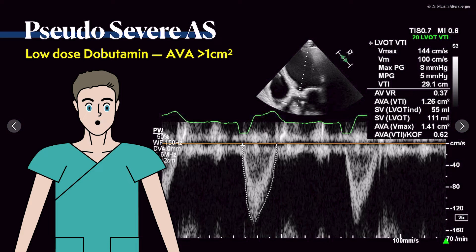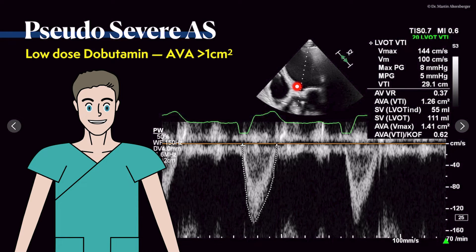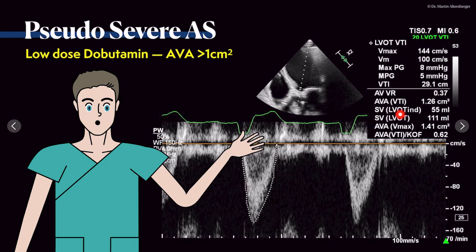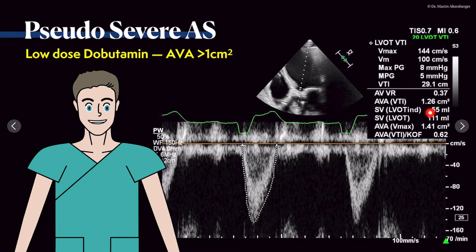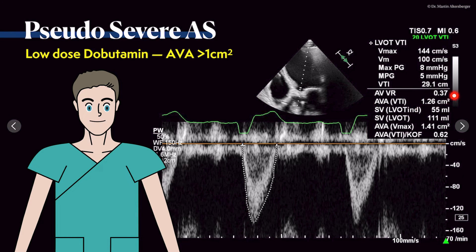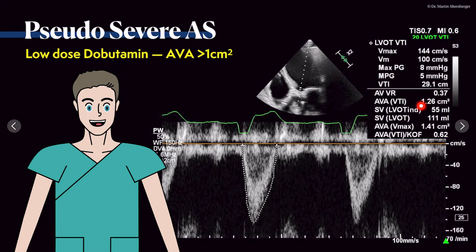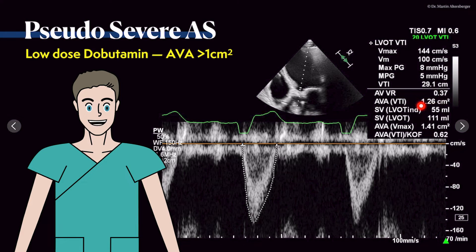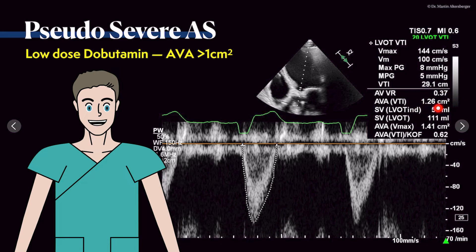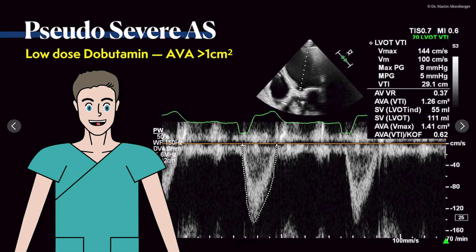We used low-dose dobutamine, and at 20 micrograms per kilogram per minute, the pulse-wave Doppler signal shows a stroke volume index of 55 mL/m² — indicating normal flow with contractile reserve. The aortic valve area now measures 1.26 square centimeters, above one square centimeter. This is pseudo-severe aortic stenosis: at rest the AVA appeared below 1 cm², but with stress echo the ventricle demonstrates contractile reserve and the aortic valve area falls into the moderate stenosis range. Low-dose dobutamine stress echo can differentiate true severe from pseudo-severe aortic stenosis.